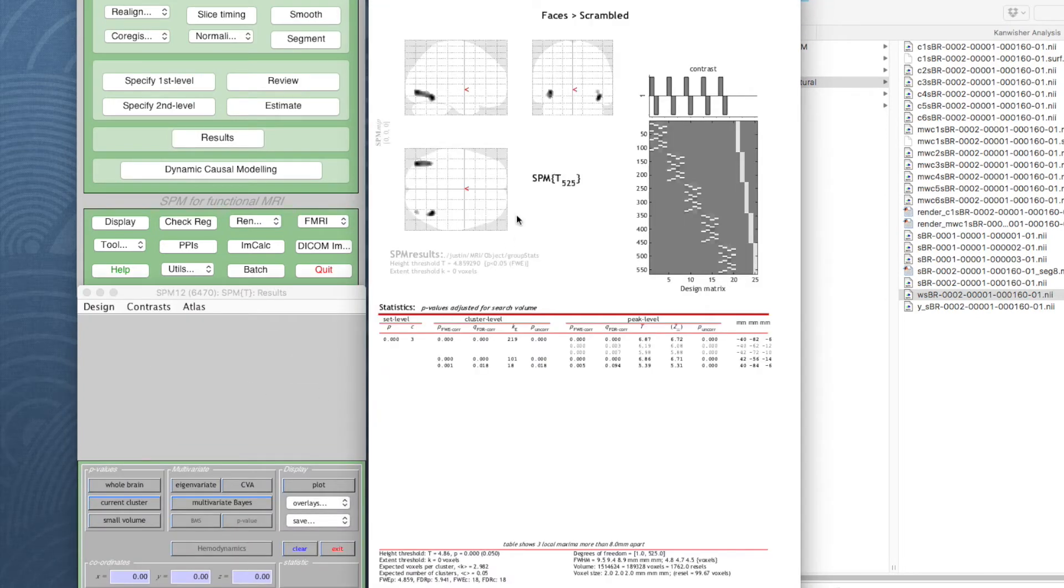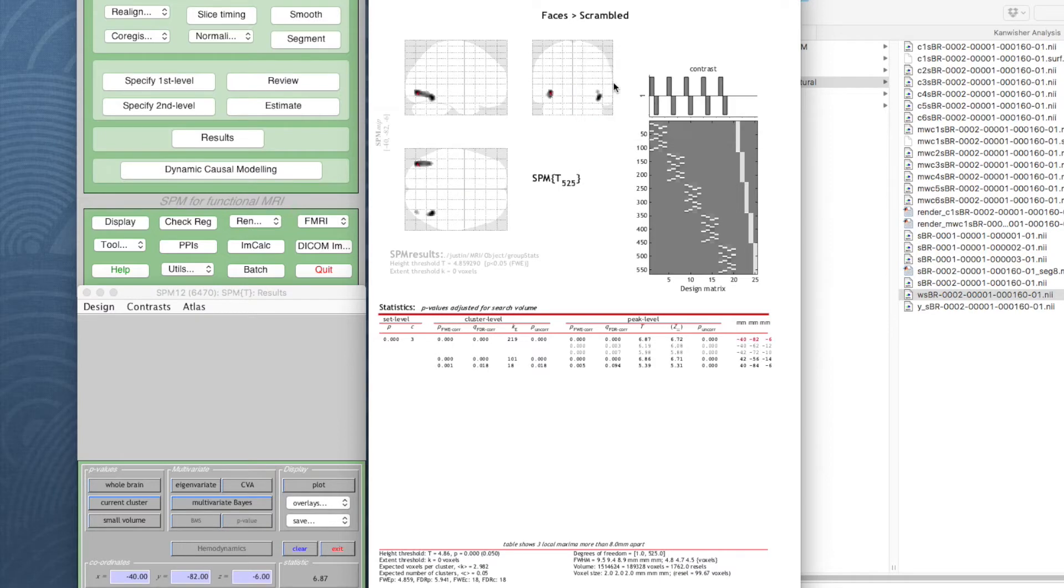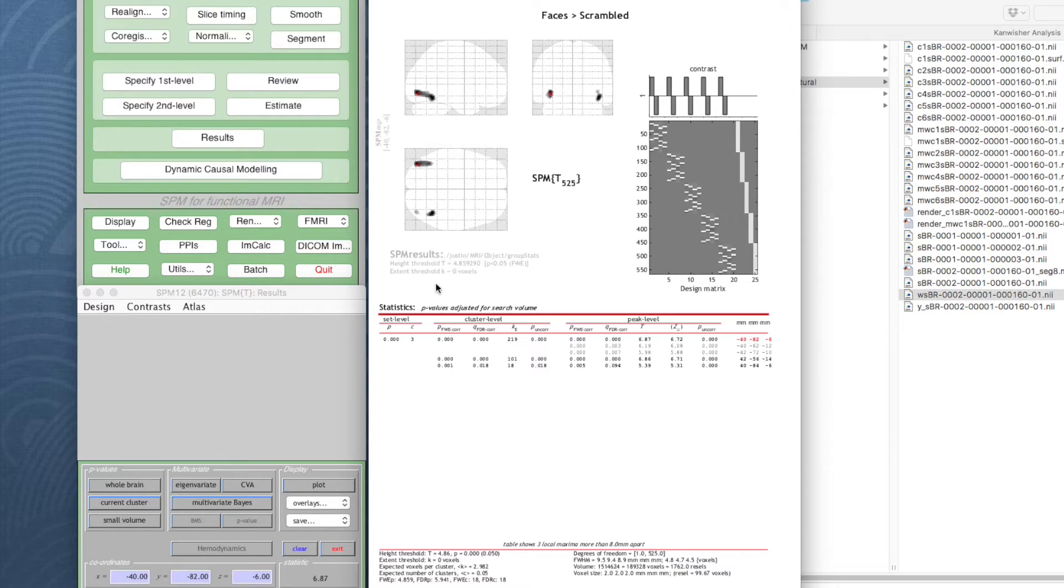What I've done here is select the SPM.mat. We've only defined one contrast so far and I've gone in with a standard t and k value, where t is the height threshold, the probability that's corrected, and k is the extent threshold which we set to zero. This box shows everything rather than just large clusters, and we can overlay that data on slices or sections.